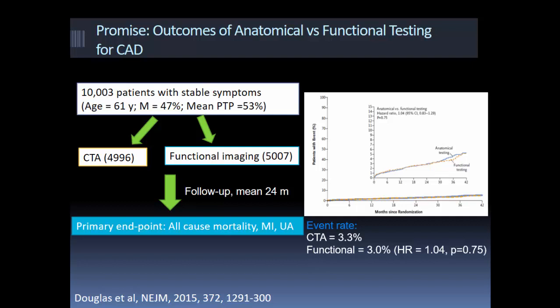And I think the prognosis from non-obstructive plaques has not come out in this follow-up. If you follow up for 5 or 6 years, you probably will see a divergence of the curves, with more events in the patients with worse CT, with disease on the CT angiography.